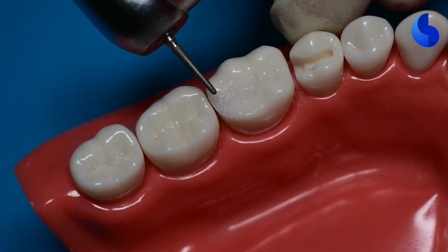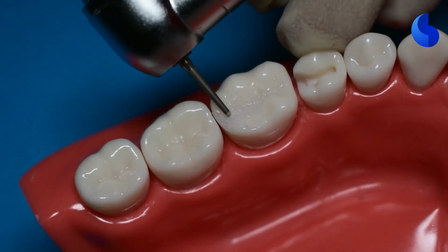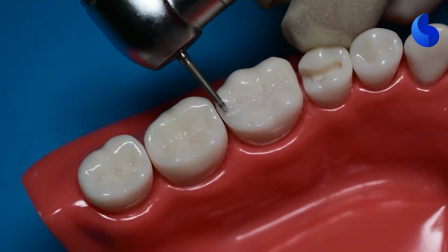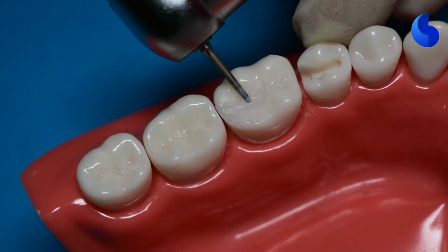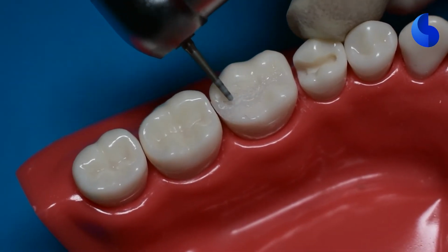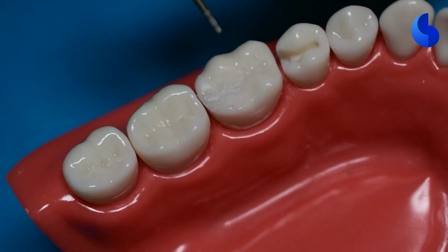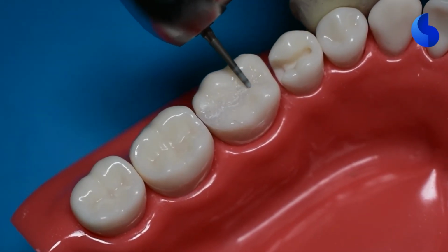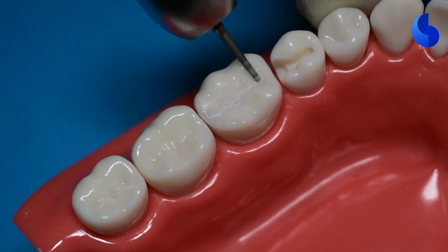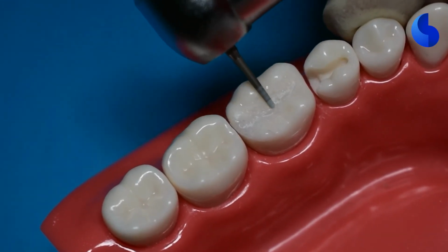At this point, we're ready to finish this restoration. So you can start off by gross reduction of excess material that may have flown over to your tooth structure, using a slow speed burr and a diamond or a carbide. A diamond usually works out well for gross reduction. In this case, we are still following the anatomy of the occlusal surface with the rise and fall of the cusps, and just going around, smoothing out the surface, removing any excess that may have flown around.